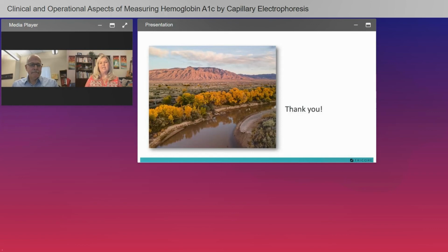Thank you so much. Now, Dr. Grenache, in the case of a homozygous variant, why not indicate to the clinician that the RBC lifespan is likely affected and no measure of HbA1c or glycated HB is useful? Yeah, the person who asked that is very observant. And I recognized that as something we needed to start doing as I prepared this presentation. We have a similar comment when there's elevated hemoglobin A2, which is suggestive of a beta thalassemia. But we neglected to add that to our comment when there is a homozygous variant. So that will be remedied. I thank the questioner for pointing that out.